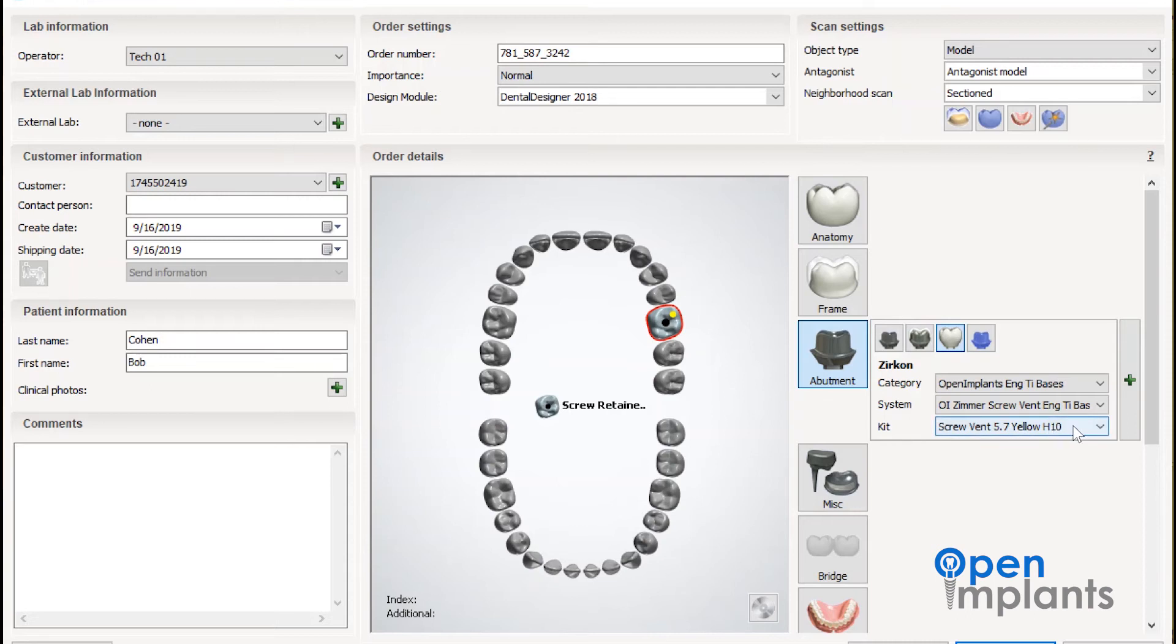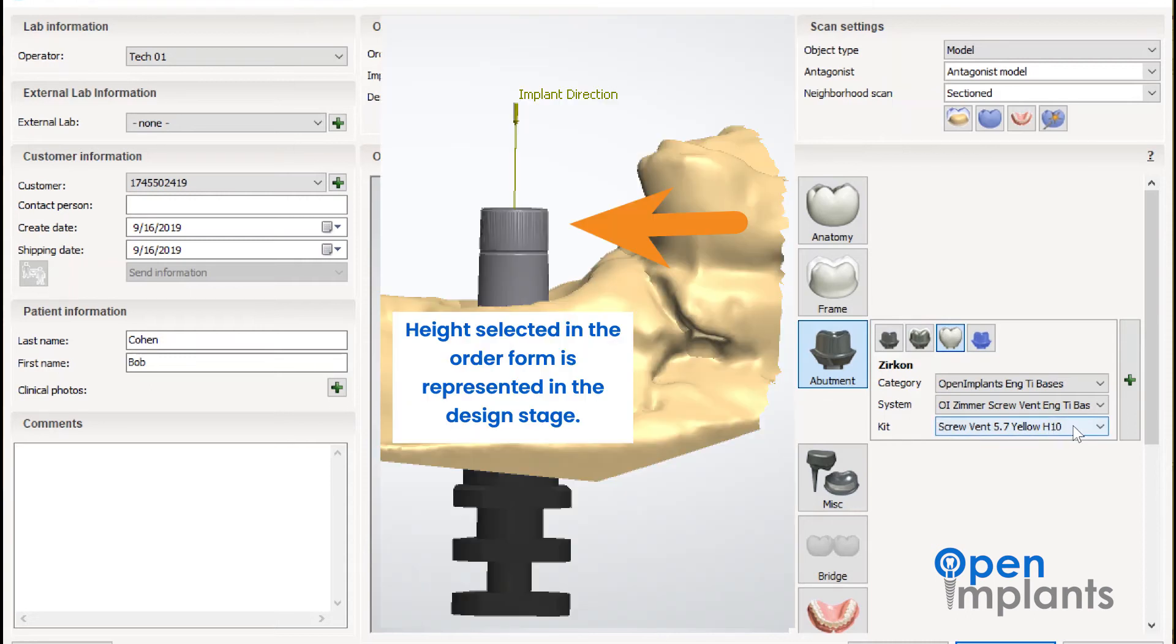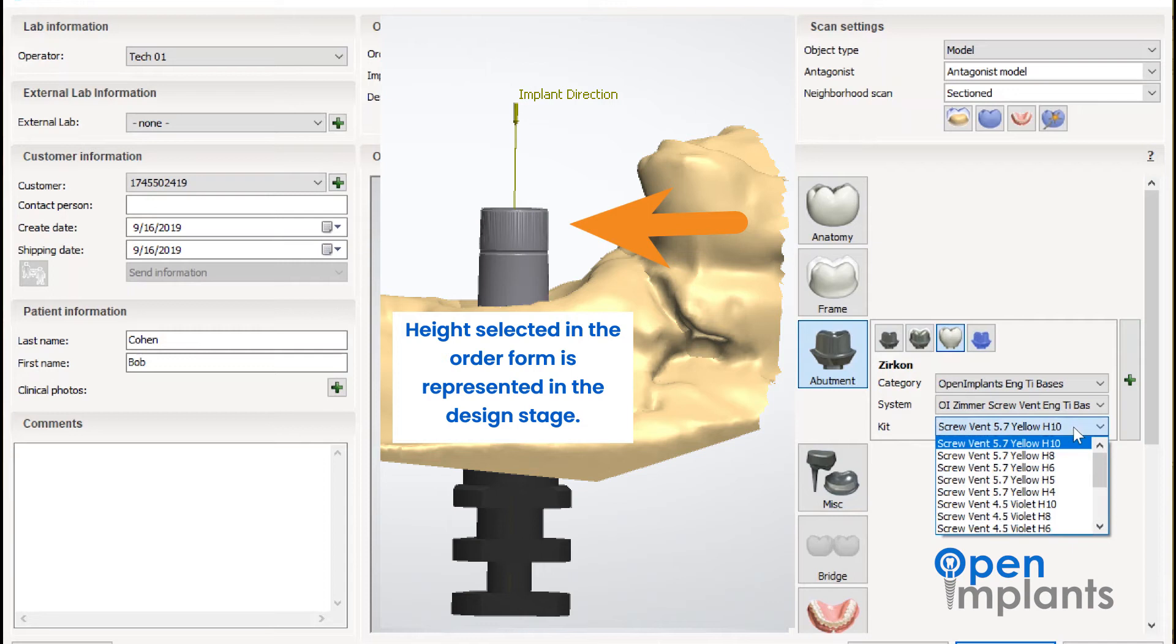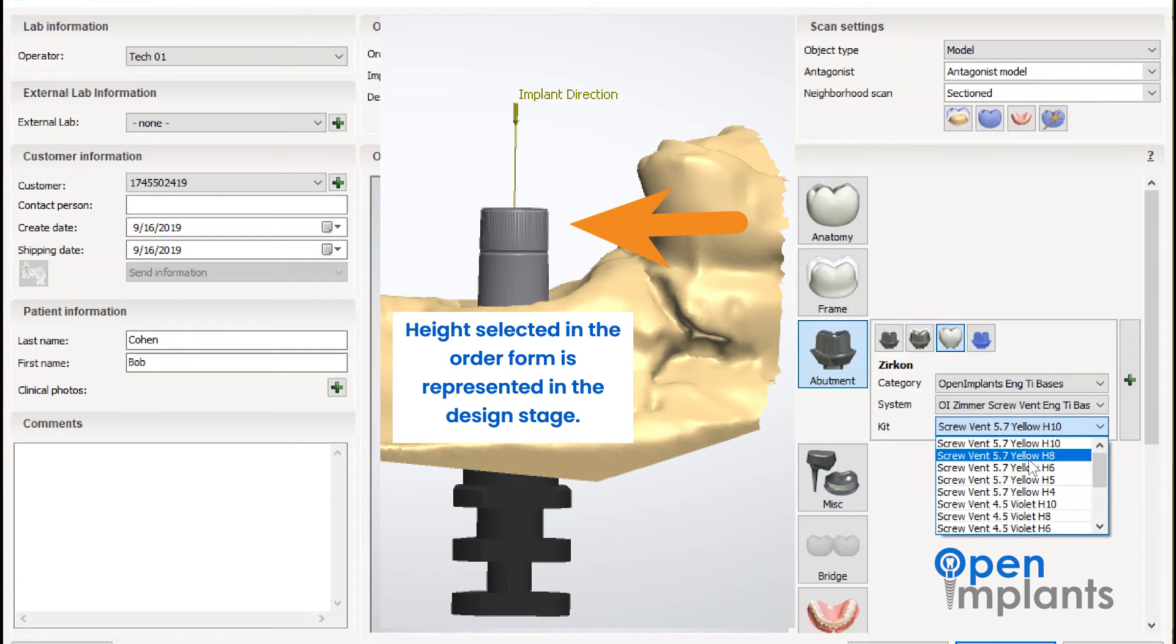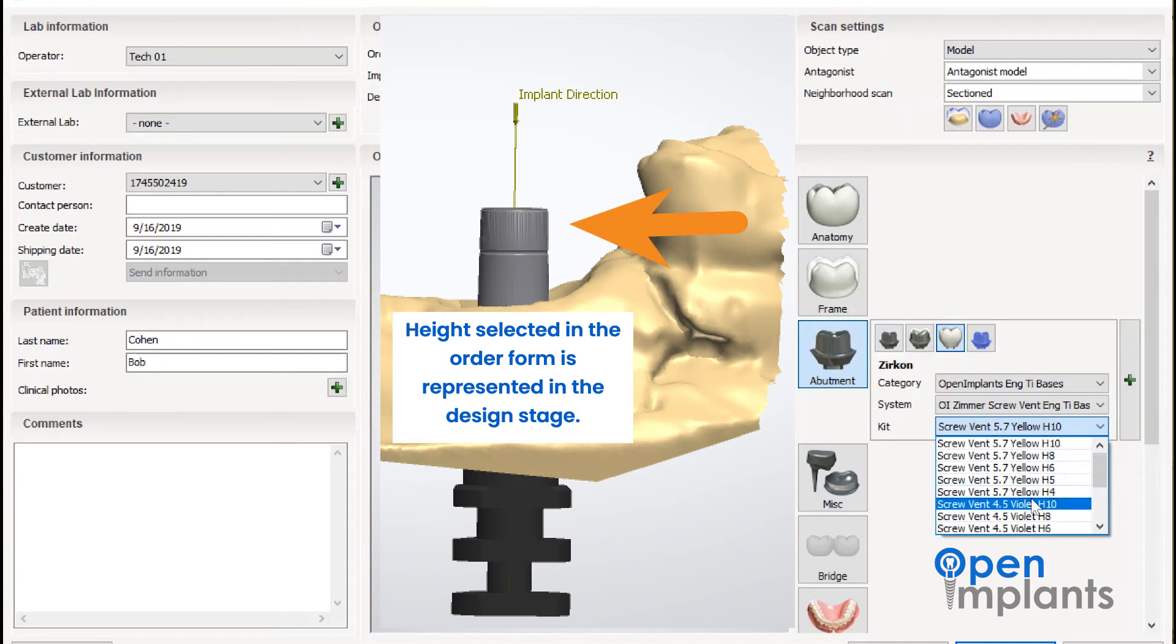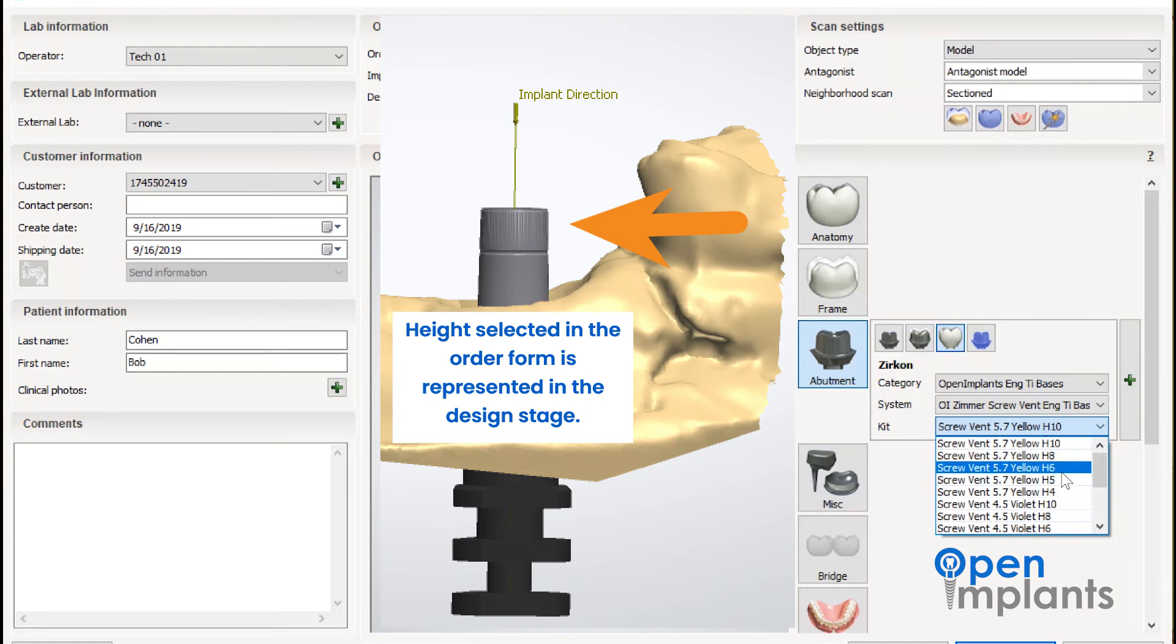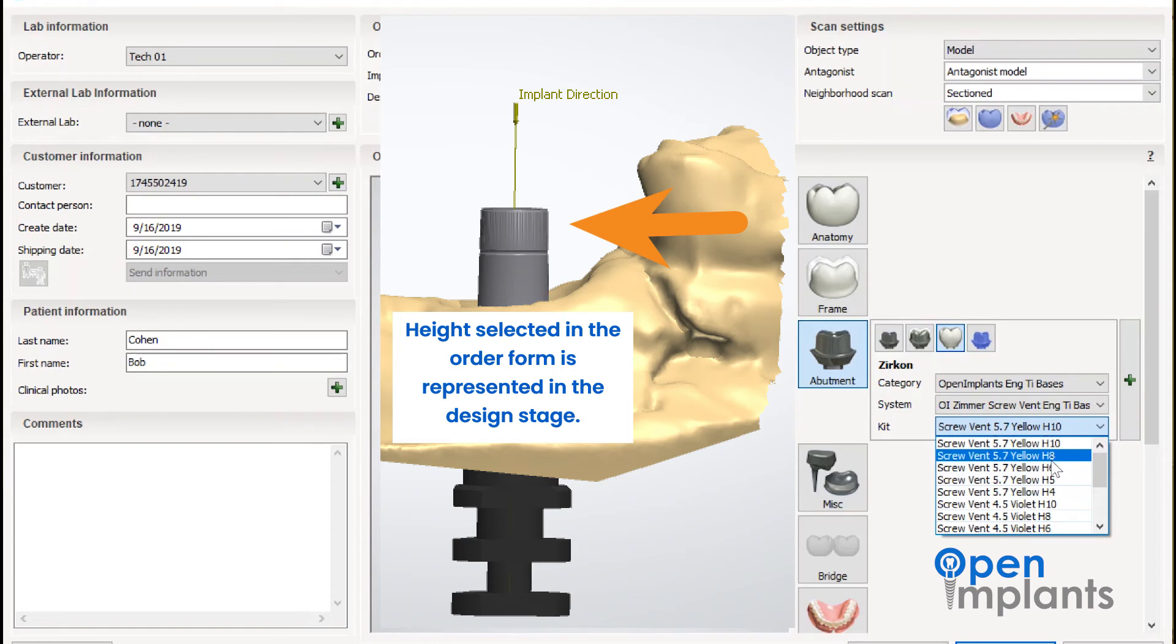The last thing you're going to want to consider is the implant height. This might require a little bit of pre-planning on your part. Note that you are selecting the final height at this step. So if you have a 10 millimeter tie base and you wanted to make it a 6 millimeter tie base, that's the selection that you're going to pick.